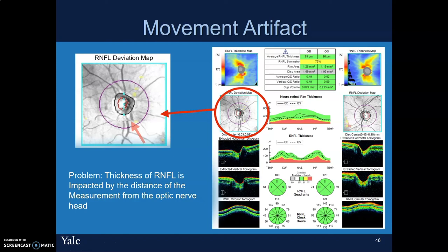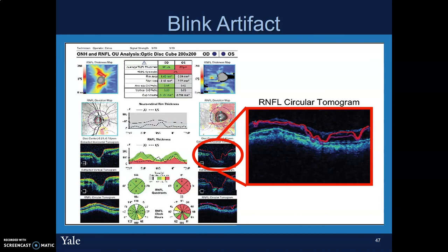Here is the movement artifact. If we look at the deviation map, the blood vessels are not continuous because the patient moved their eye or moved themselves during the scan. Similar in concept to the decentration artifact, because RNFL thickness is impacted by distance from the optic nerve head, we're going to get errors as a consequence. Here's another familiar artifact — the blink artifact. If we look at even just the regular thickness map, we can see the patient likely blinked, resulting in poor scan quality and generalized depression on the quadrant analysis and average RNFL.